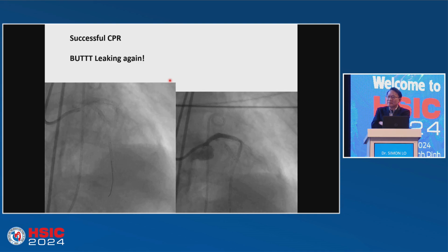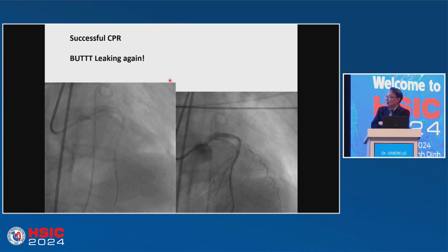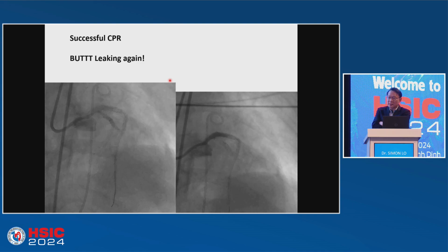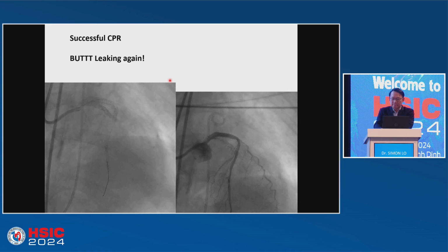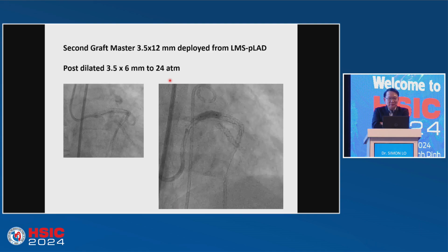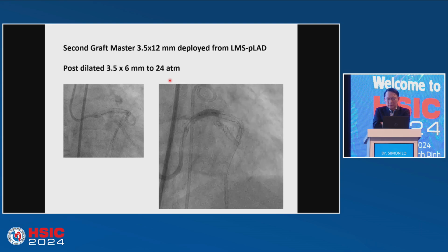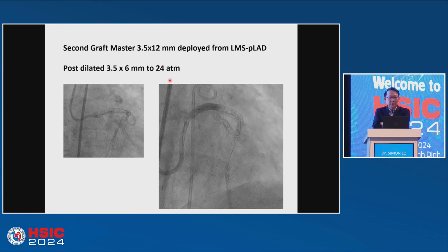Now, I am stuck, you know, and what should I do next? I've already implanted almost 3 stents in the left main to the LAD. And it's already almost 11 o'clock p.m. Anyway, this Graftmaster managed to get 2 stent grafts over. One was 3, the other one 3.5. So I managed to get the 3.5 in and put the stent graft in the left main at the bifurcation, into the LAD.